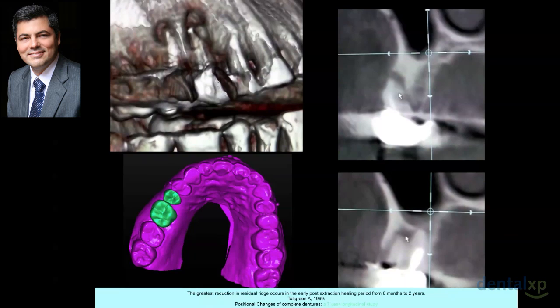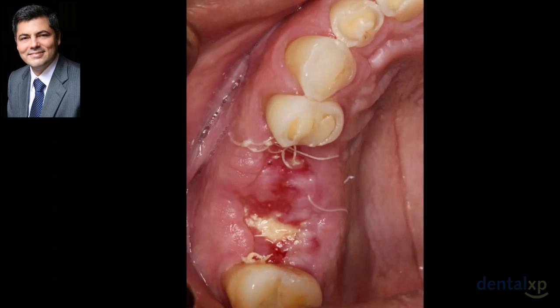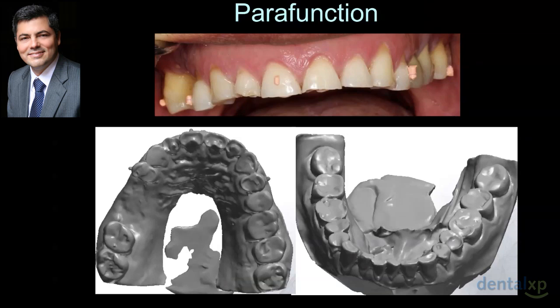This is a classical example of a patient that is going to lose two teeth, and today we are doing digital setups utilizing STL models that are interposed or interconnected with the Cone Beam CT images, and this is a virtual setup utilizing the software. And we have been able to recreate the upcoming restorations. The extractions are made and the site is grafted utilizing a socket preservation technique, trying to enhance the site. And we can observe the aggressive destruction created by the parafunctional habits of this patient.